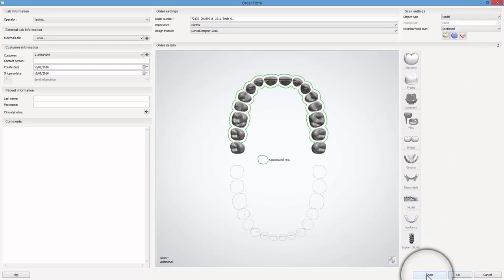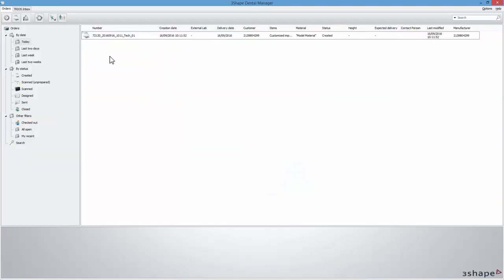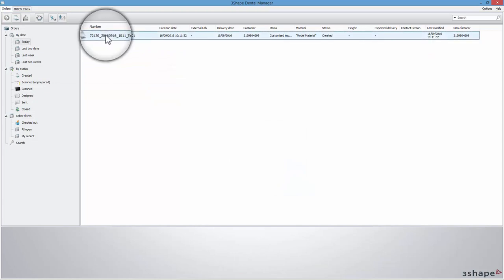Click Scan to start the scanning process, or OK if you have already scanned an impression. For our example we will now import the scan.